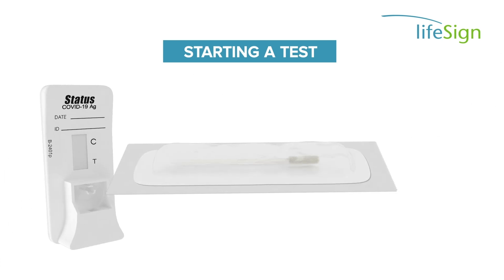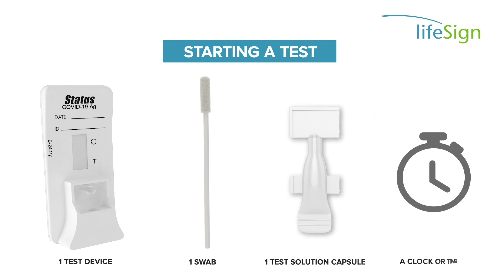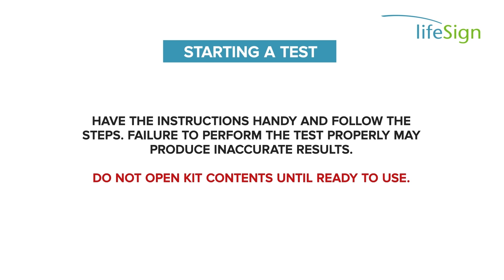For each test, you will need one test device, one swab, one test solution capsule, and a clock or timer. Have the instructions handy and follow the steps. Failure to perform the test properly may produce inaccurate results.